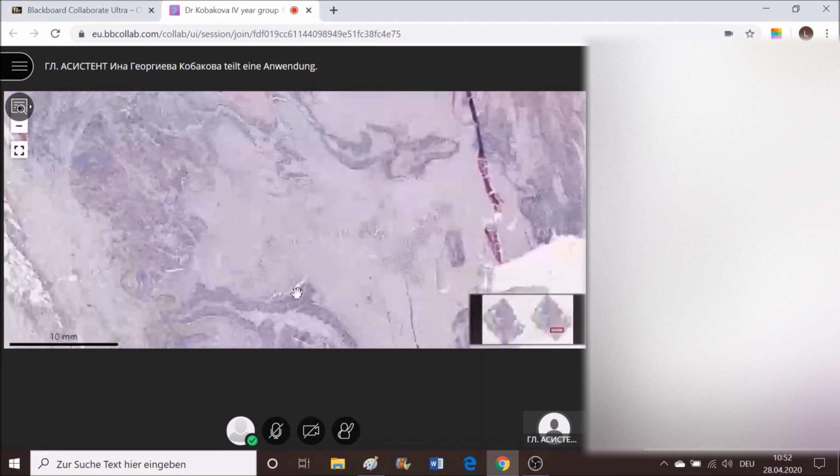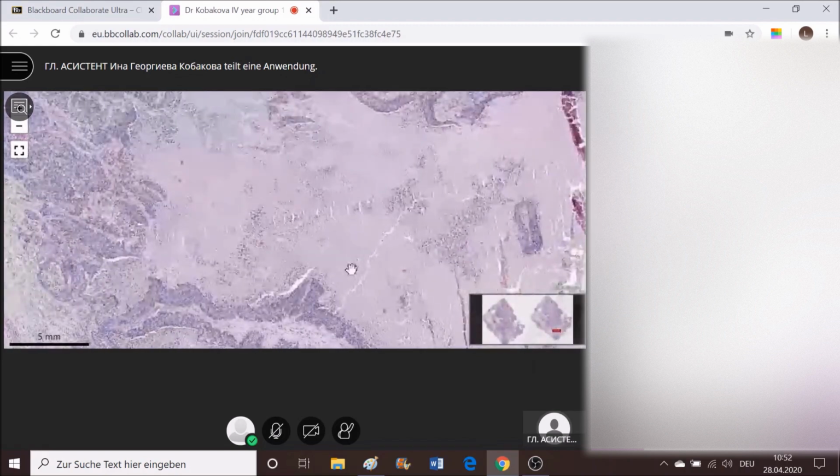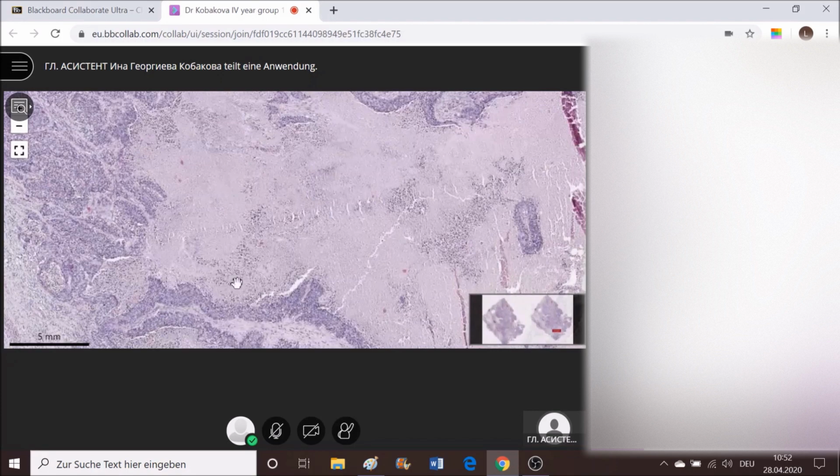And now let's take a look at the tumor here. First thing, what is this field here? Is it recognizable? It's completely amorphous. Some small portions of anthracotic pigment remnant. Acellular. What is this field here? How would you call it? At the center of a tumor nest or something. How do you call it? It's a tumor. Necrosis. No, it's not stroma. Stroma should be something cellular with nuclei. And this is necrosis at the center of a tumor nest.